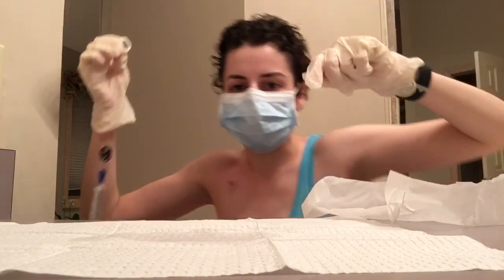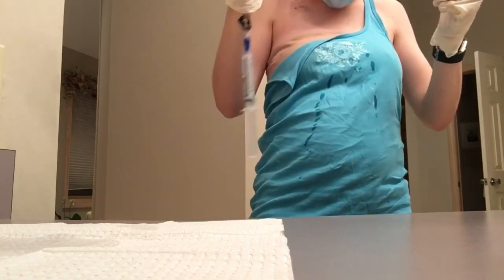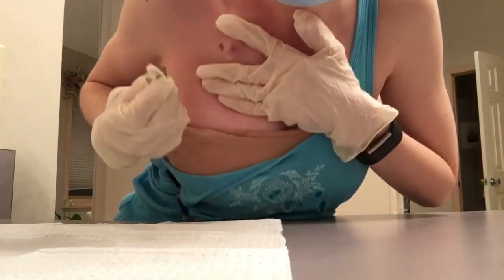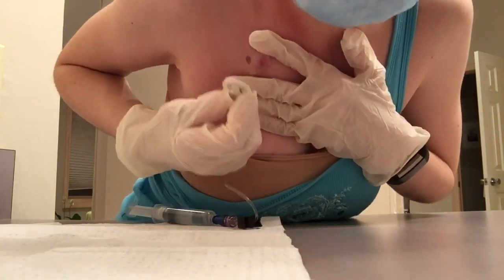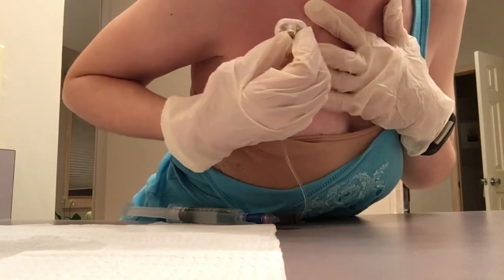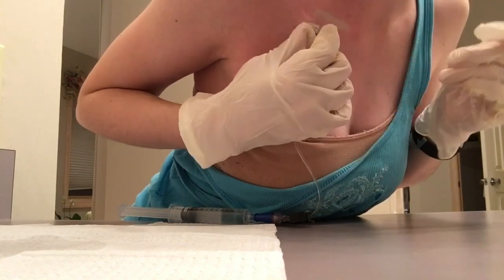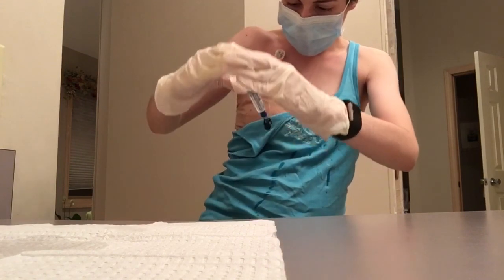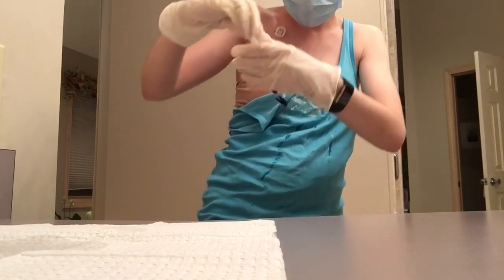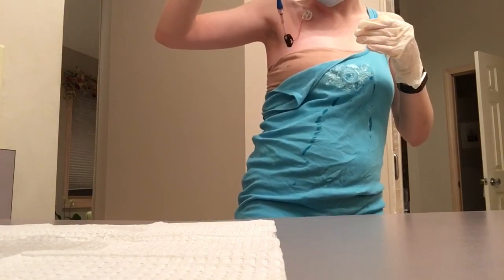And now I'm going to access and see if you can actually see how I'm just using my elbow and my elbow. See me access this and using the side of my arm for my clothes. Oh, this is kind of hard to see in the mirror in the phone. So I'm gonna look in the mirror. Just spread your hands out, not your arms out. Push saline, sorry. Pull back, blood, that means I'm in, and I can tell when it's in or when it looks crooked.